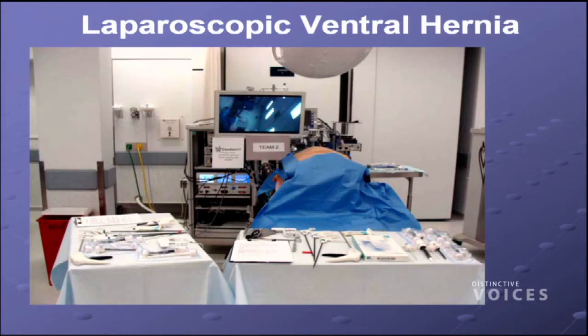I have played with some of the VR simulators, and there are pros and cons to using physical models versus virtual reality models. I can actually make the physical models more difficult than the virtual reality models. The graphics are better on VR, and also you're able to collect data.